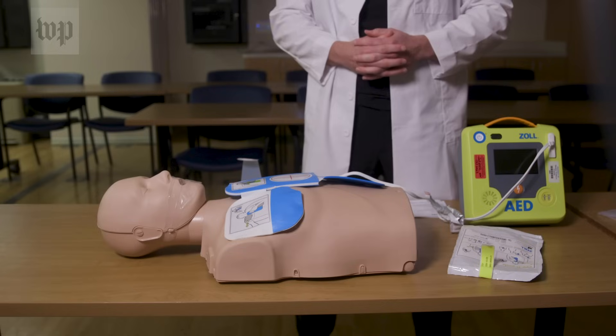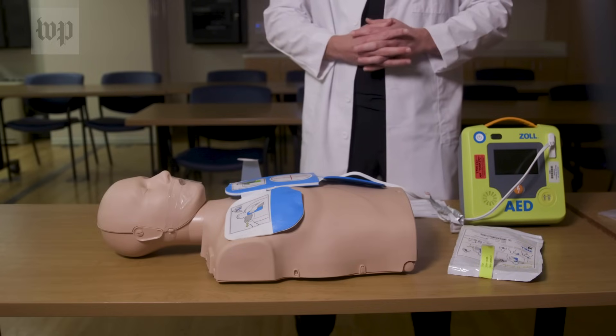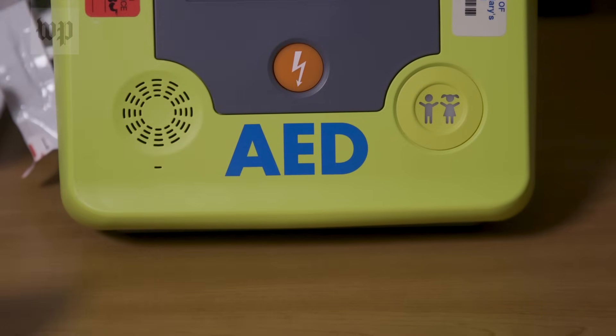If the device tells you that a shock needs to occur, have everyone stay clear of the patient, don't touch the patient, and press the shock button on the device. When you press that button, it will deliver a shock.